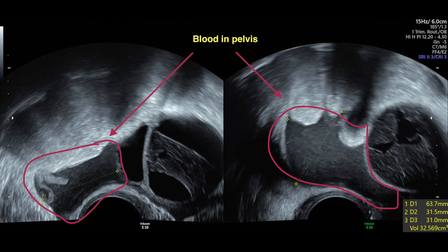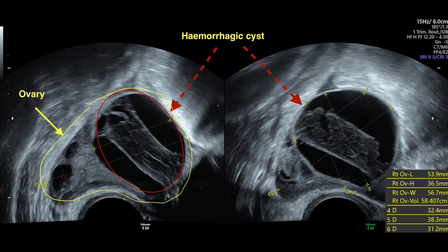Also seen next to it is a hemorrhagic cyst with a clot retraction in the center of the cyst.